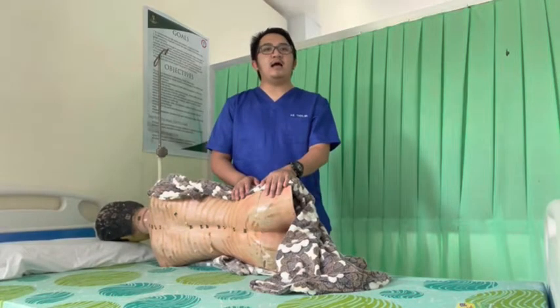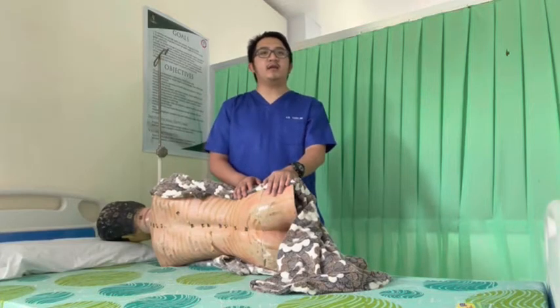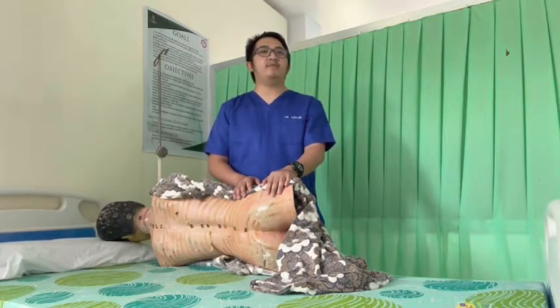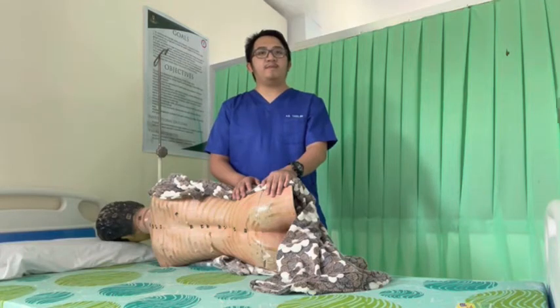Next, the physician applies a small dressing to the puncture site to protect it. The tubes of CSF are sent to the laboratory immediately for processing by the laboratory technologists.